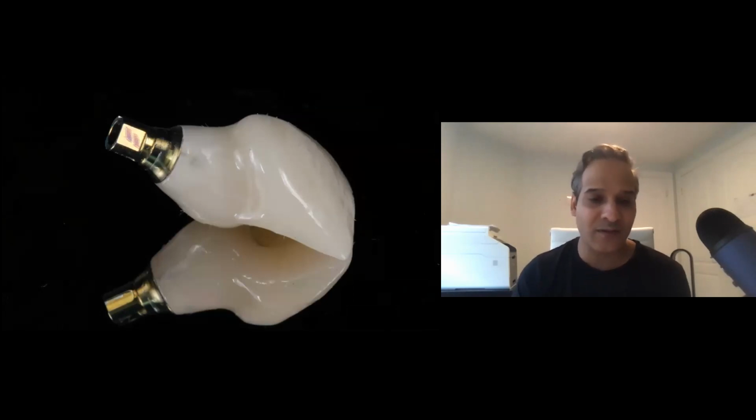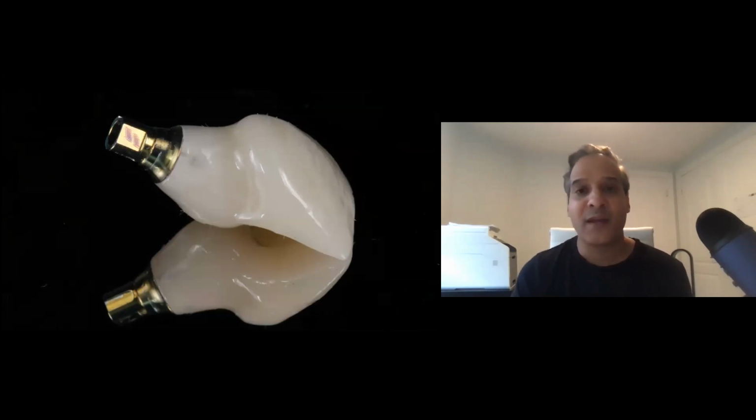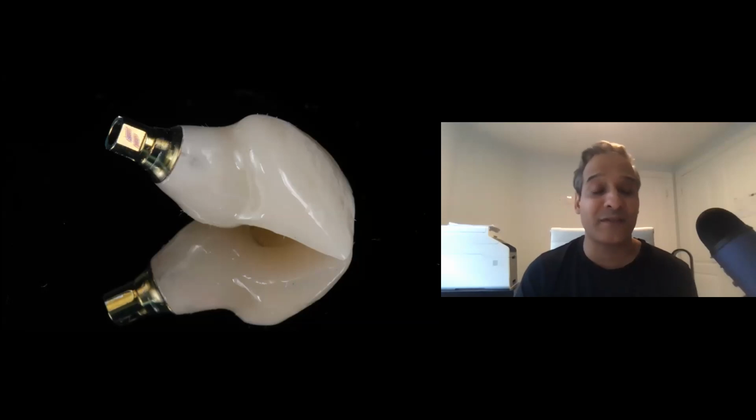So what we did was we scanned the implant. I told the lab I need a temporary, but I need you to make the temporary to mimic the neighboring central and give me a better emergence. Don't give me a ridge lap. I want to remove that emergence. So this is the temporary that they made. This is done basically ahead of time. So the day of surgery, I'm inserting this temporary with the tissue graft at the same time, because they're going to guide each other to help shape the tissues.